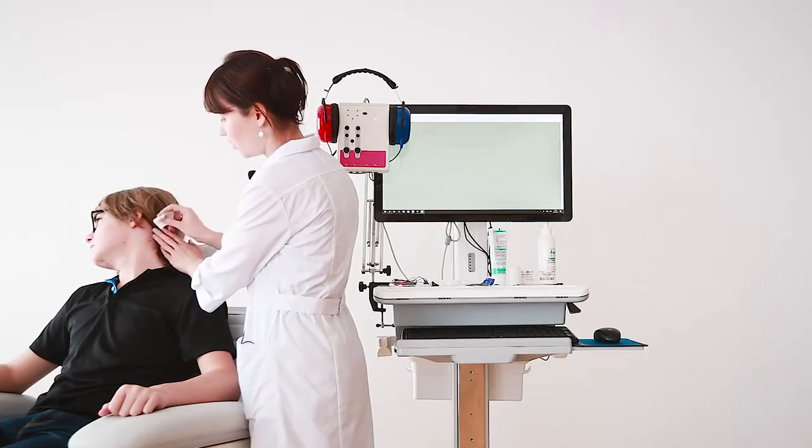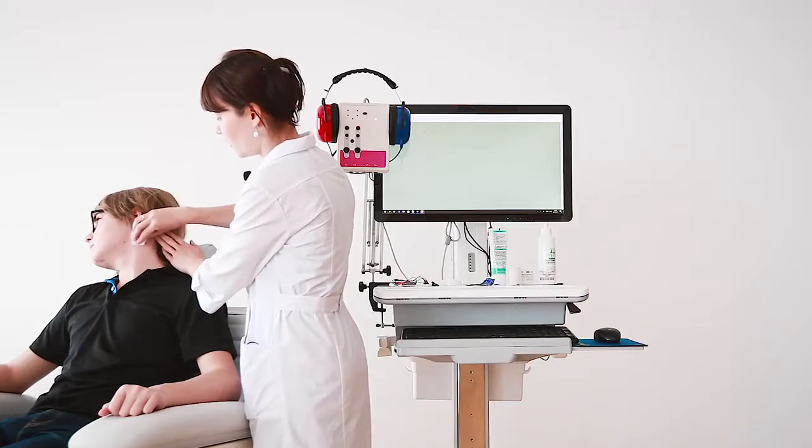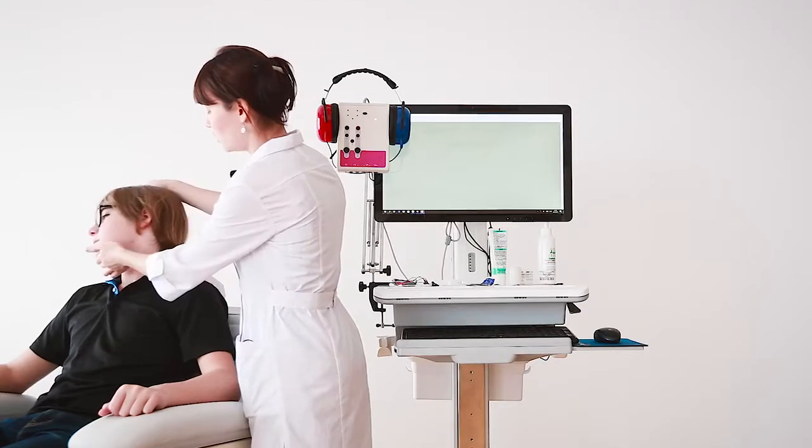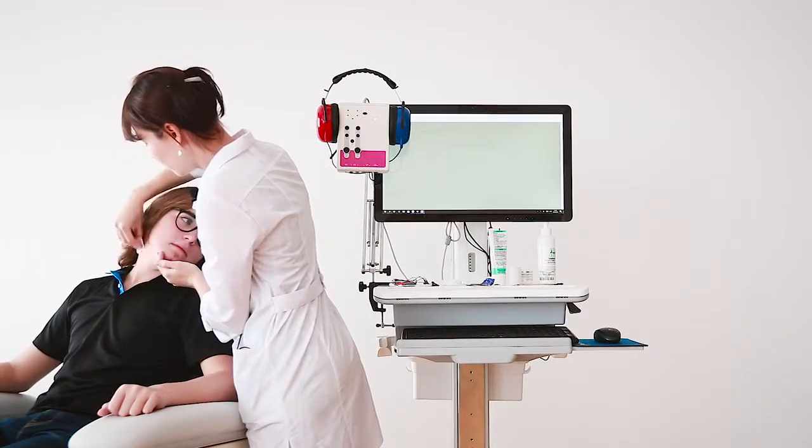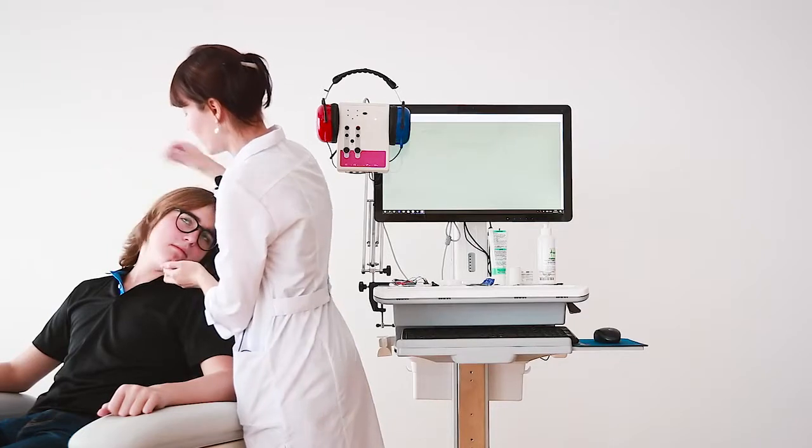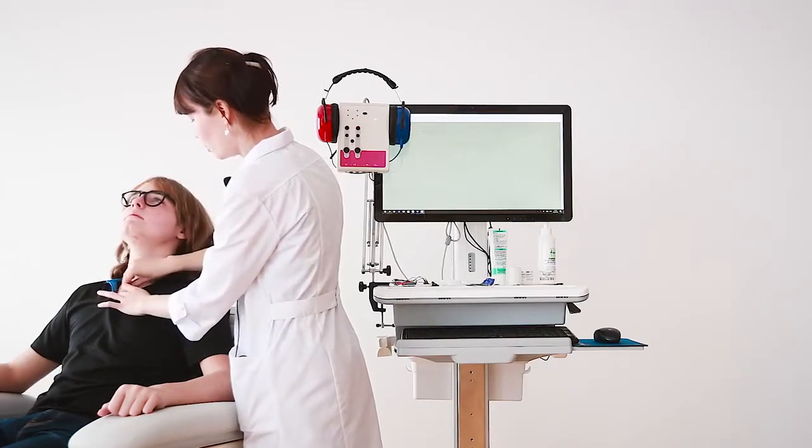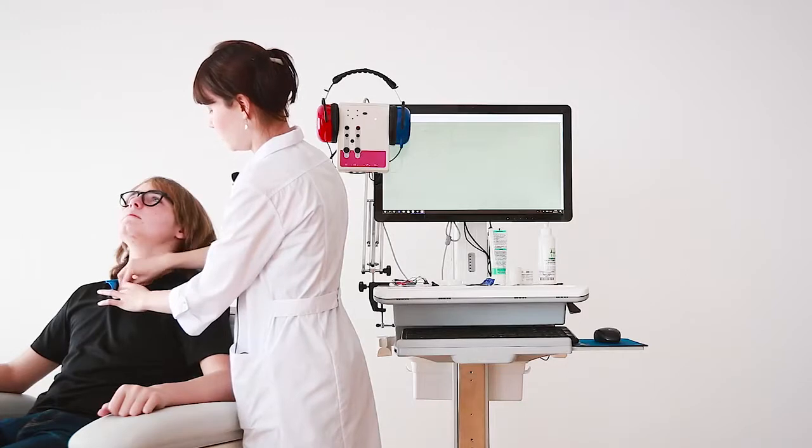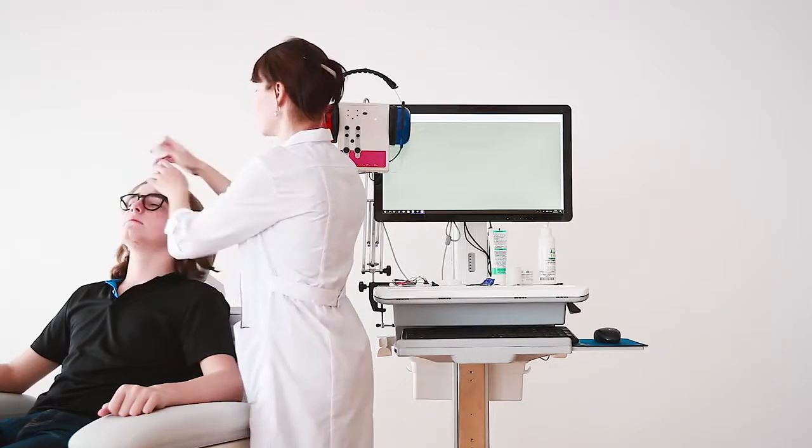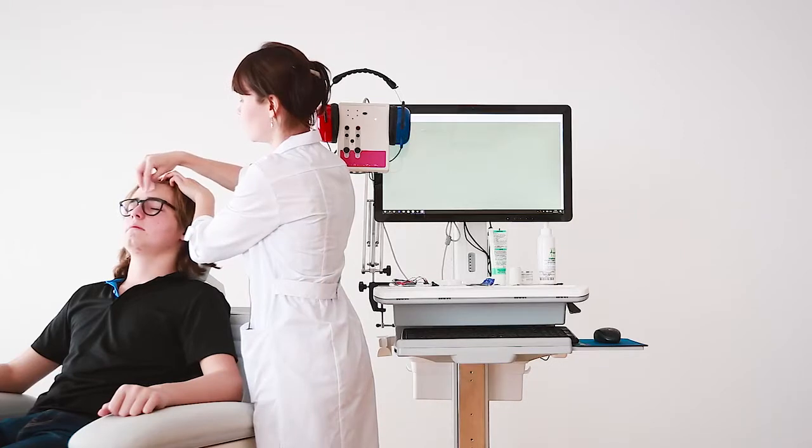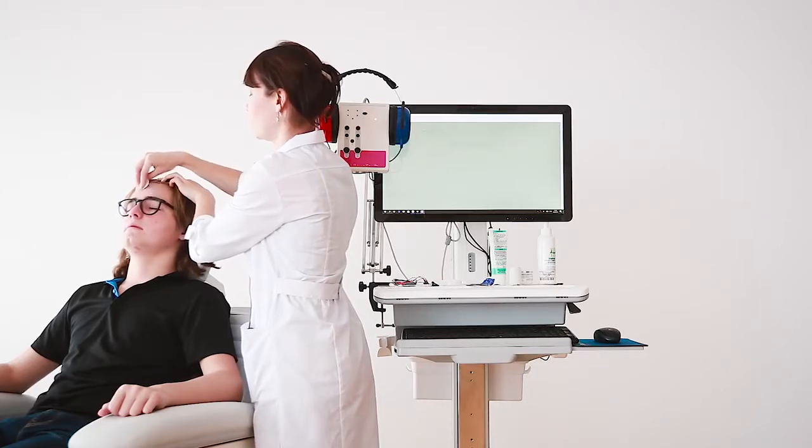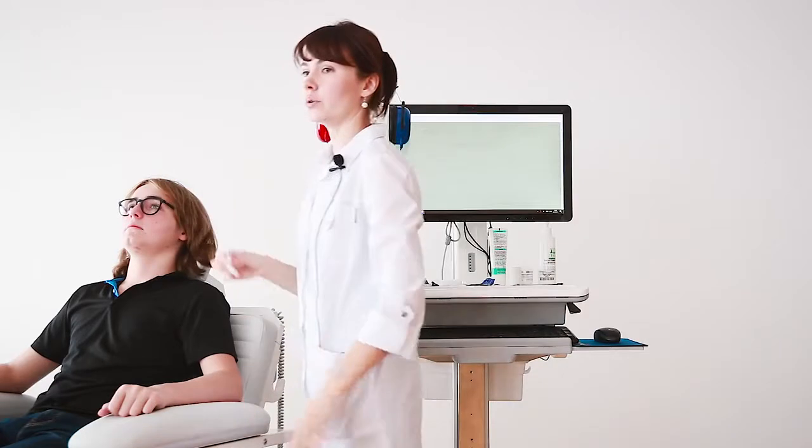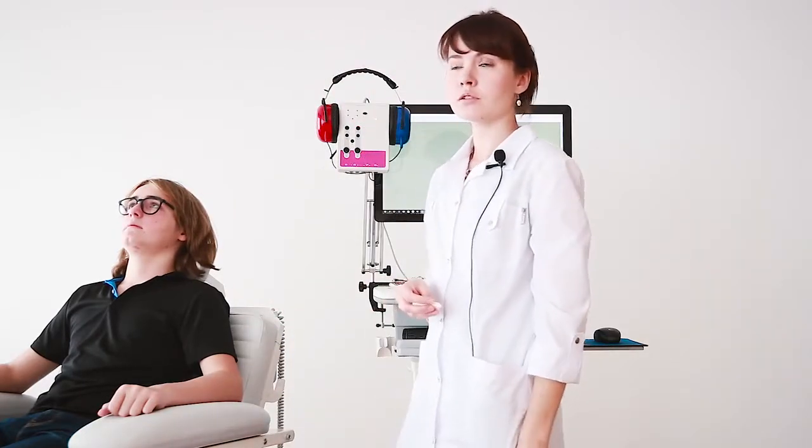The active electrode we will position on the sternocleidomastoid muscles in the higher half of the muscle on one side, and on the other side. The reference electrode we will put on the clavicular.